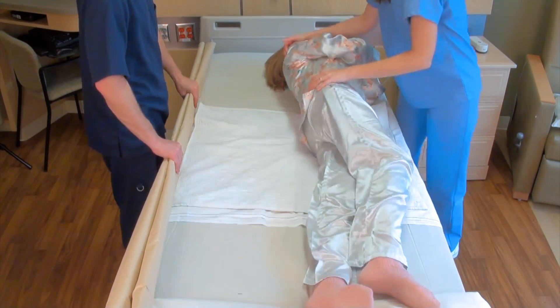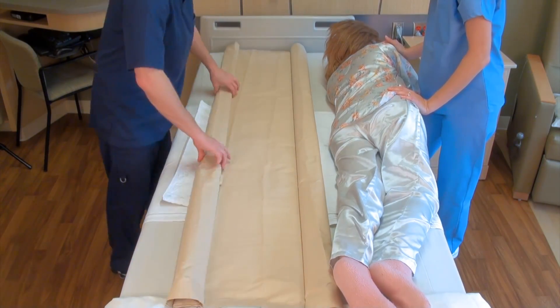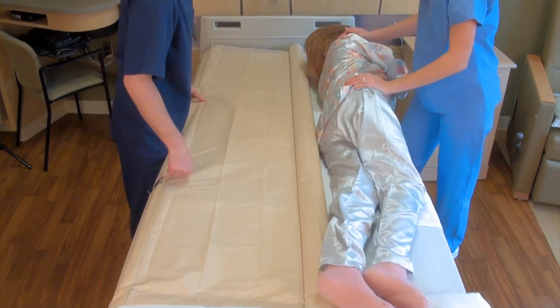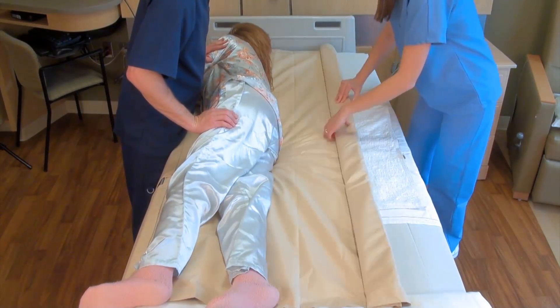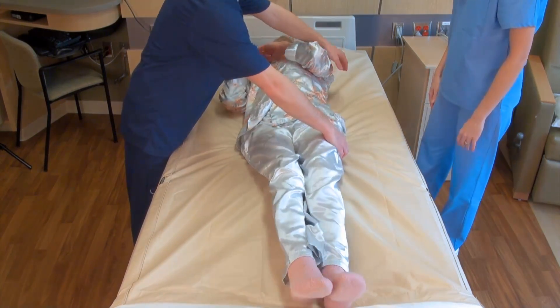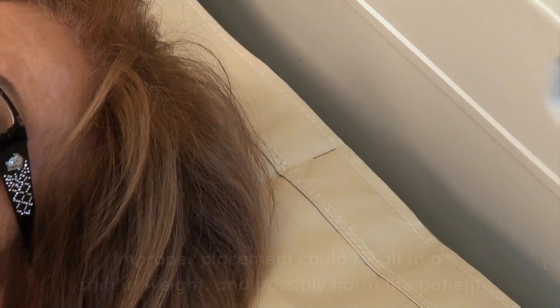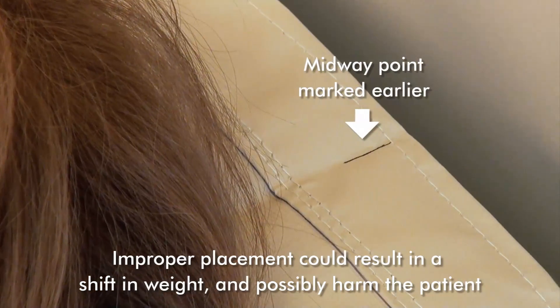Place the stretcher alongside the patient and work it underneath them by rolling them first to one side and then to the other, much like changing a bed sheet. The patient's weight must be centered along the length of the stretcher as much as possible so that when lifting they remain horizontal. This is very important, as improper placement could result in a shift in weight and possibly harm the patient.